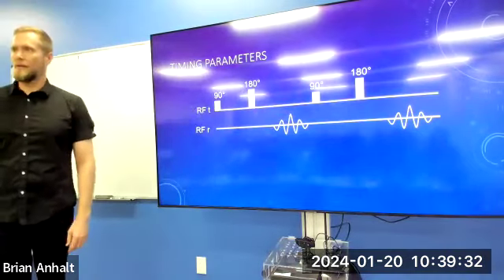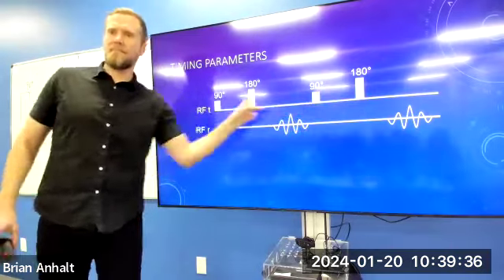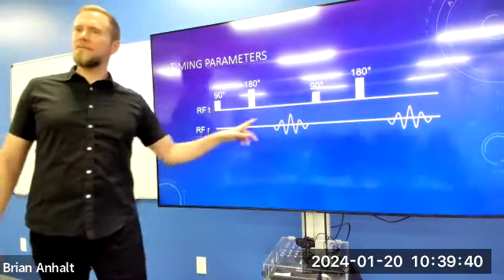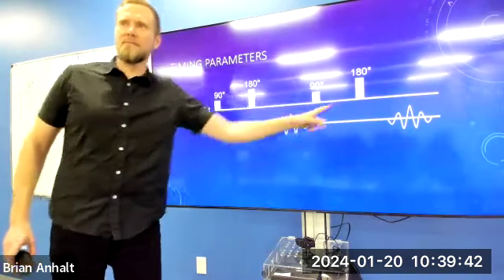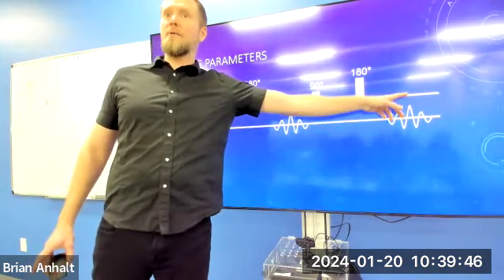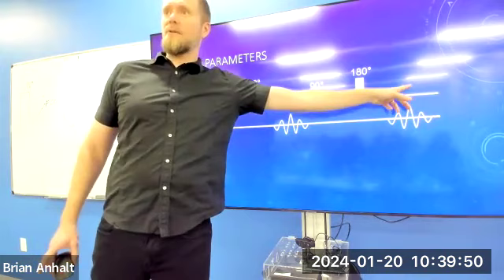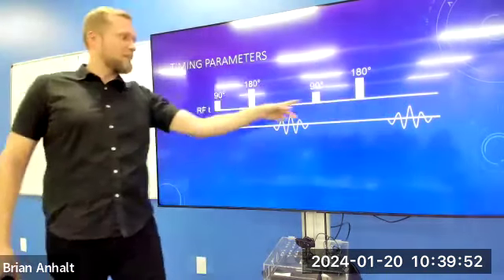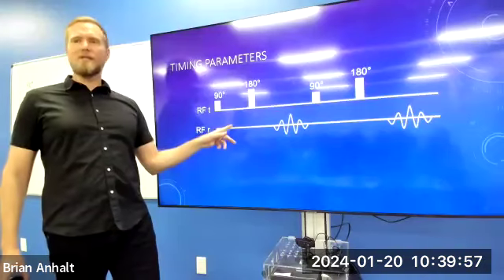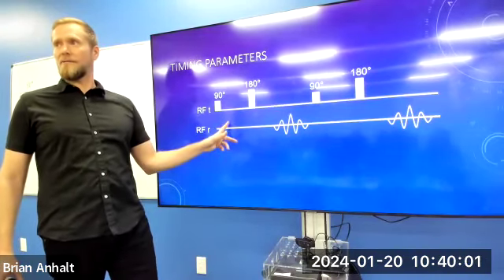And once again, you as an operator can change that time to see more or less true T2 effects, right? If I prescribe a longer TE, I'm going to see more T2 interactions happen and get more T2 contrast. If I prescribe a lower TE and transmit that 180 much quicker, not many true T2 interactions are going to happen. It's going to minimize my T2 contrast.